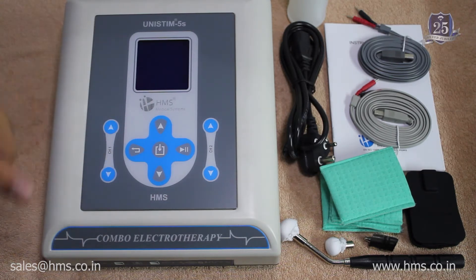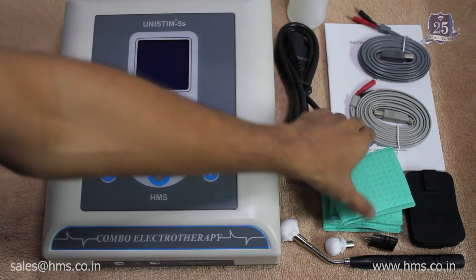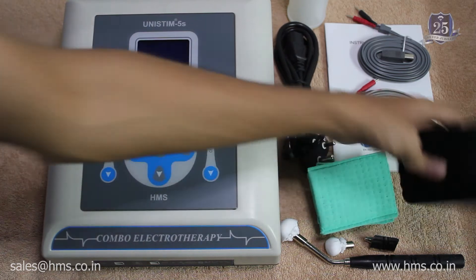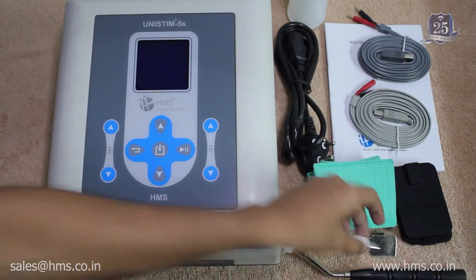This is the machine itself, and now we'll go through the accessories that come along with it. This is the power cable, and these are the pouches to give wet treatment using the electrodes. These are the electrodes themselves — you get two pairs of electrodes, and also a pin electrode with a couple of tips for it.